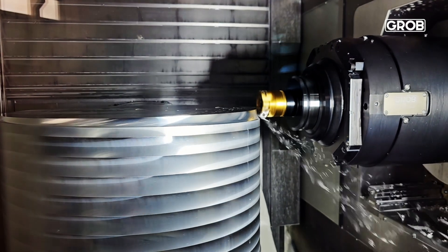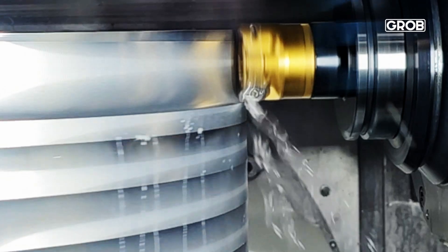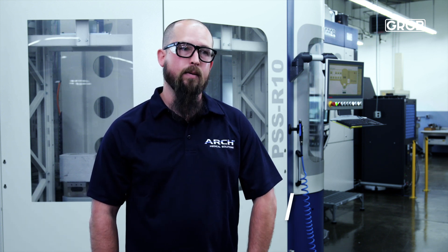Five-axis gives us a lot more opportunities to reduce startup time by having less complex fixtures, and we were able to get at more of the part at the same time. Being at the machine at five-axis, it cuts down on our ops. We can do the parts in one or two ops on the same machine — sometimes on the same pallet — reducing cycle time and touch time for the employees.